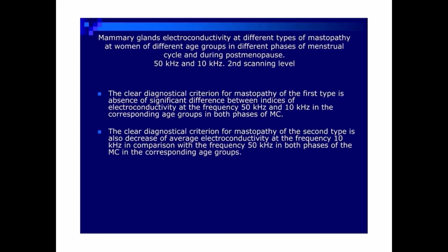The clear diagnostic criterion for mastopathy of the second type is decrease of average electroconductivity at the frequency 10 kHz in comparison with the frequency 50 kHz, in both phases of the MC, in the corresponding age groups.